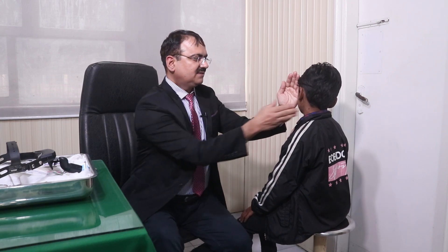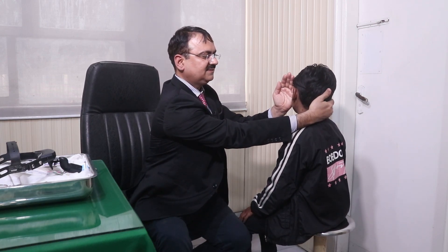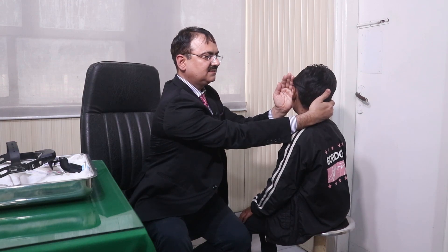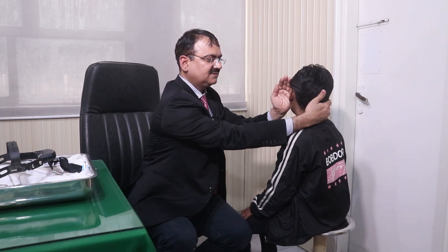In one ear, you should not allow the patient to read your lips. You have to close your eyes. I will give sound — numbers — and you have to repeat them back. The other ear should be blocked with the tragus. Numbers given: 6, 4, 8, 10, 15, 20. The patient can listen even to a whisper sound.